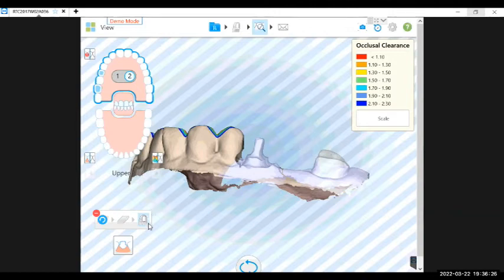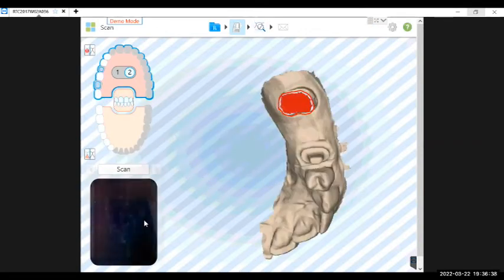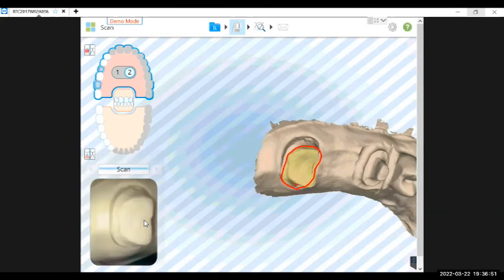But maybe that'll be a future update. So once I enclose the top half, I can click right here on the scanner icon, and it brings us back. For this, you just really need a good circle to make sure it's captured. It doesn't take too long.